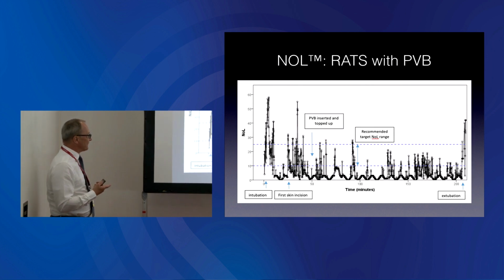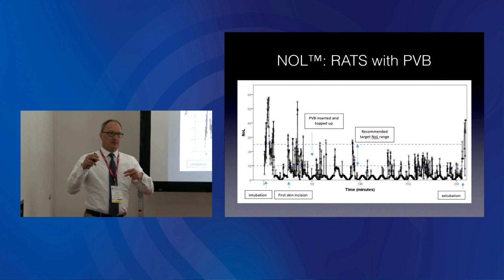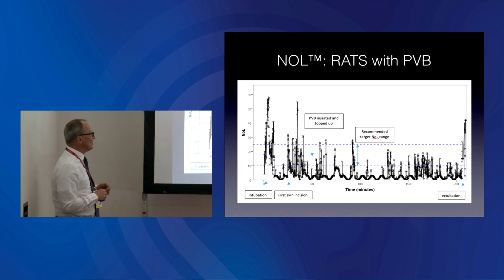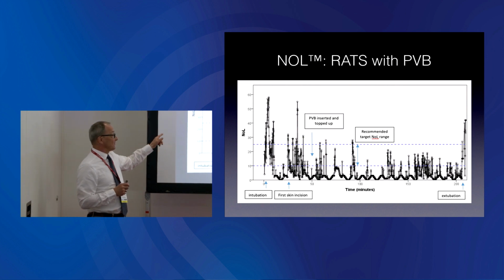You can see thereafter there is a bit of a lull when patients are positioned here. And then there's a first skin incision, and these trocars for the robotic procedure are inserted into the chest. And that again is a bit of a stimulation, as you can see, but not necessarily as much a stimulus as the intubation.